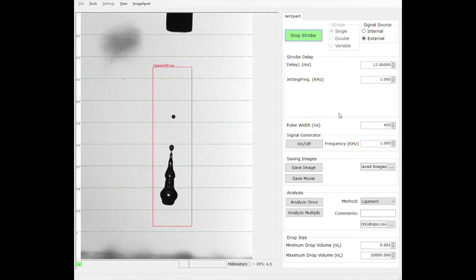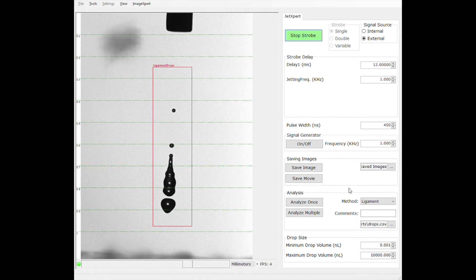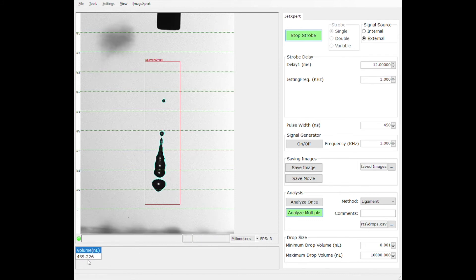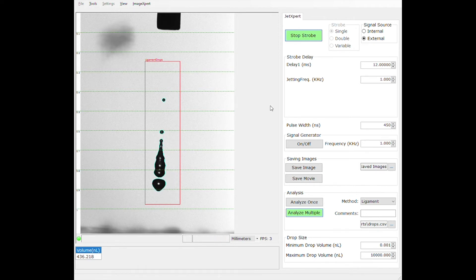If we're interested in getting a measurement of the drop volume, we can perform analysis on the drops as they're being captured. Right now we're measuring the volume of all of this fluid within the region of interest for all the drops that are going by.